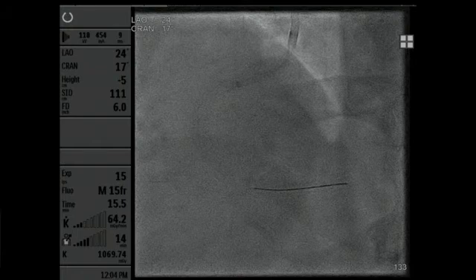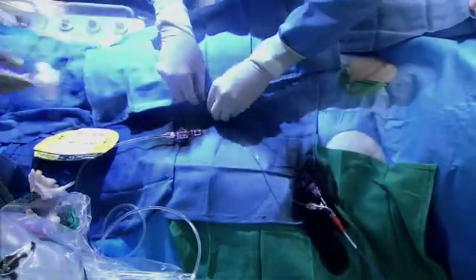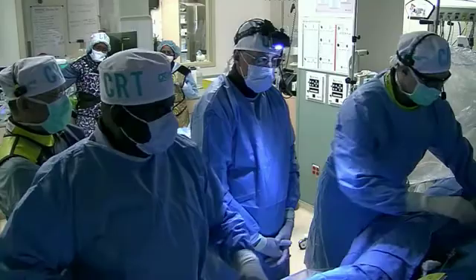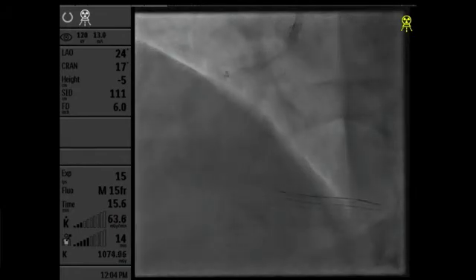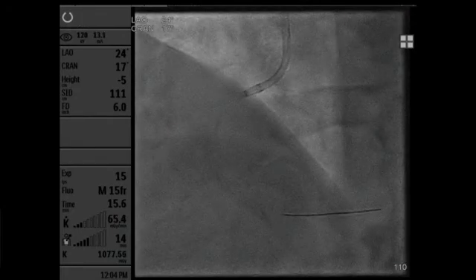So Ron, just a question to the panel. For people watching this live case today, the question would be: Dr. Robin has a very good balloon, giving a 3.0 by 15 compliance. What is the role of doing lesion modification, either using rotational atherectomy or orbital atherectomy, if IVL does a very good job in modifying the lesion and ensuring good vessel wall preparation for stenting?